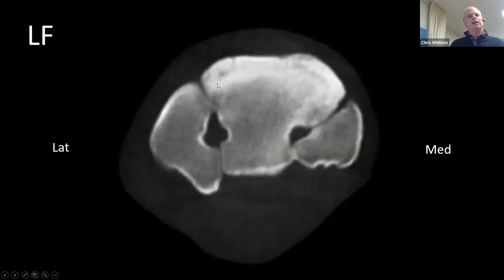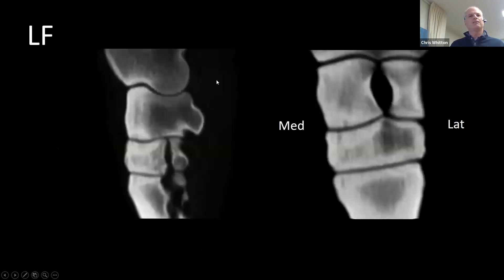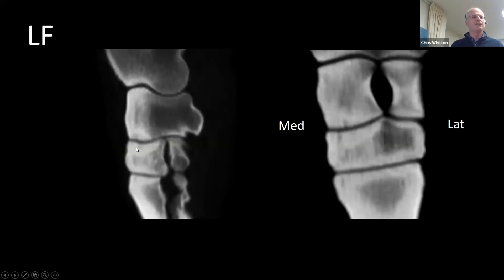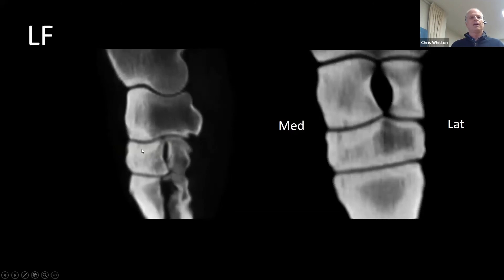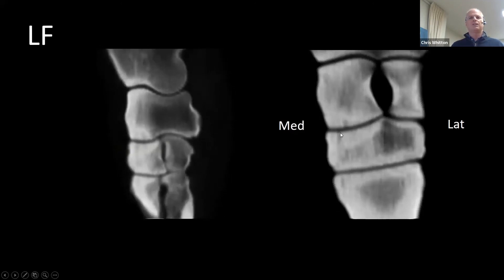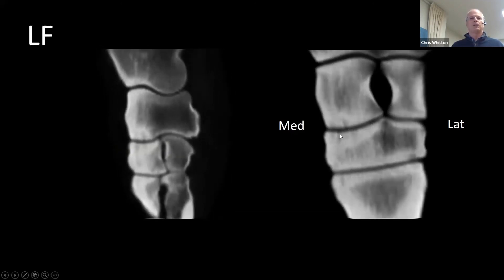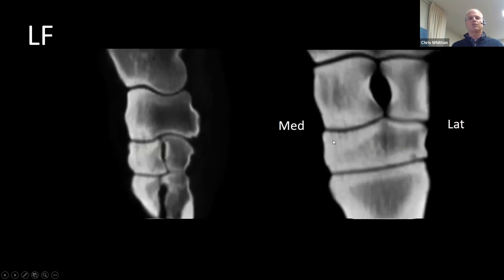From the x-rays we were a bit suspicious that something's going on there but we don't know exactly where it is, and with CT we can be much better at working out exactly where it is. Here's the sagittal view showing some radiocarpal lysis and the areas in the third carpal bone that are lytic. The same is seen on the medial aspect — multiple areas of lysis surrounded by sclerosis, and here's our area in the carpometacarpal joint.